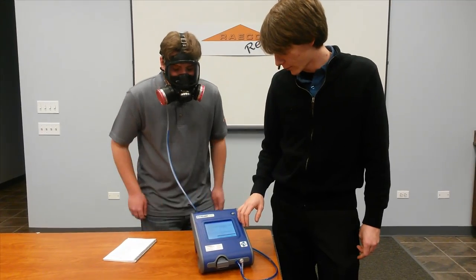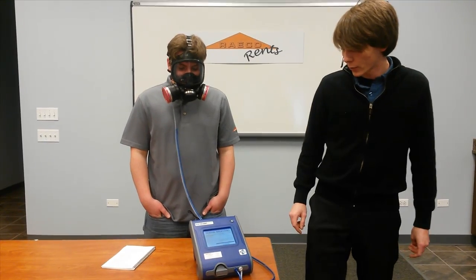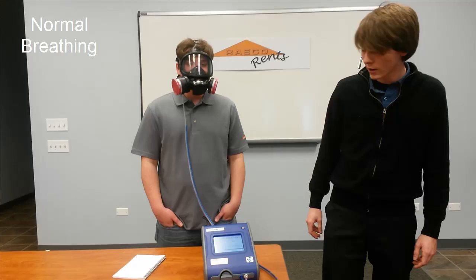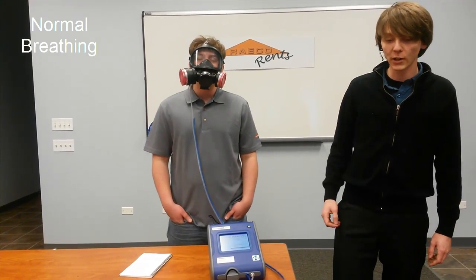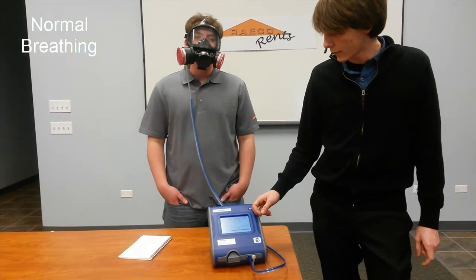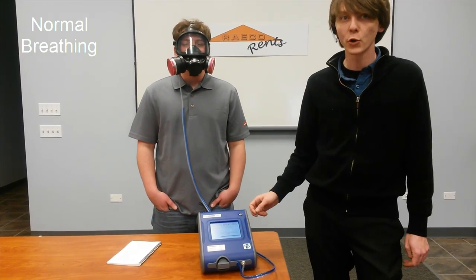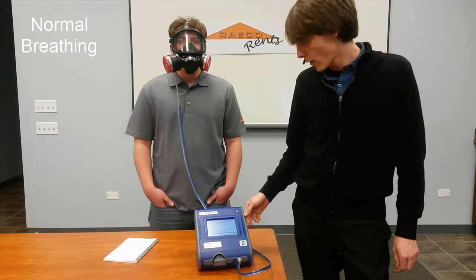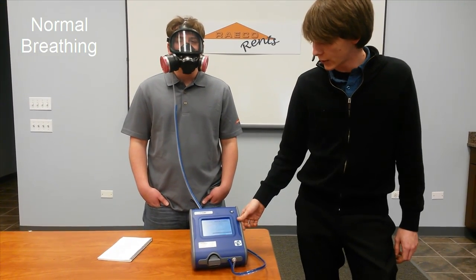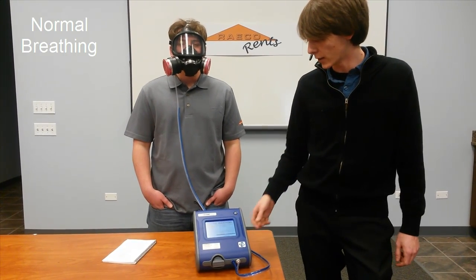Hitting the next button is going to get us to the Fit Test screen. Press the Start button and it's going to run through a few different exercises. The first one is normal breathing, so you're just going to relax and breathe normally. As it goes through each exercise on the Fit Test, it will tell you the Fit Factor for that portion. It's going to go through different breathing exercises as well as have you move around to try to break a seal on the mask.